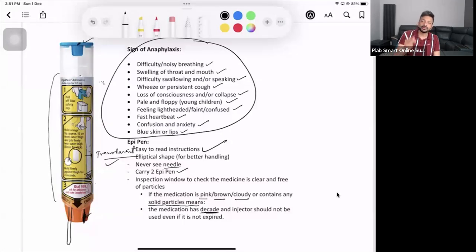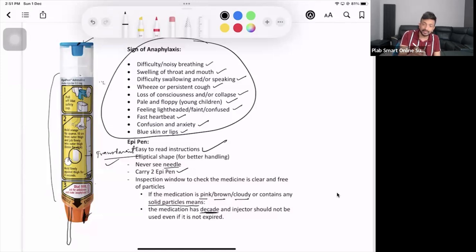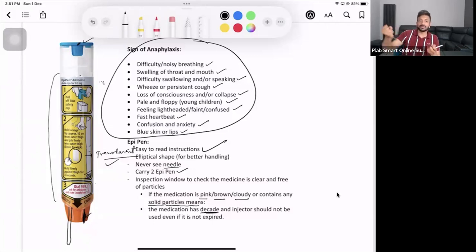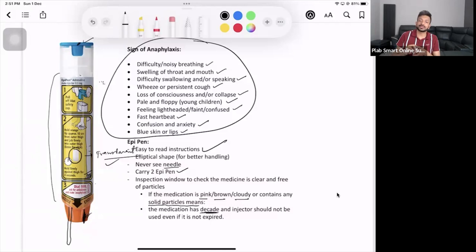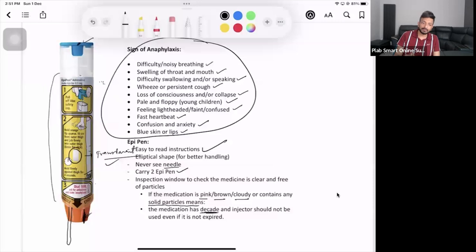Before you use it, you check two things: expiry date, check the clear window as well. Then if they have given you the EpiPen trainer, what you're going to do is demonstrate it once. You pull off the blue safety cap and you can jab it on your thigh as well, just show them a demo. If it is an EpiPen trainer, most probably they will be giving you an EpiPen trainer.